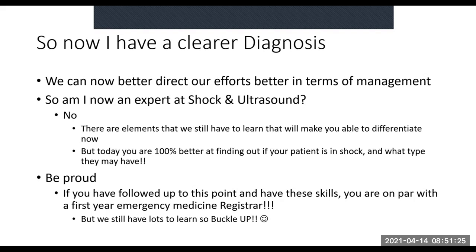And like I say, now we have a clearer diagnosis of what's going on. So it helps us to direct our efforts in terms of management. Still true, you have all the signs of pulmonary embolus, you will phone your physician, they will still not come. We know that. You can tell them everything, they still won't come.